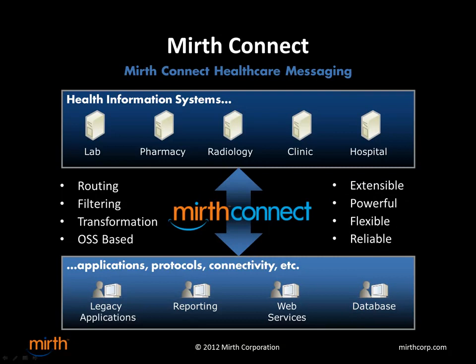So we created a tool to stick in the middle of all these different systems so that we can do the routing, the filtering, the transformation, all using this tool. So you can communicate with your lab to your legacy applications, from your pharmacy to your web services, and so on. And this tool is open source based. It's very extensible, powerful, flexible, and reliable, and I'll touch on all of those in a little bit.